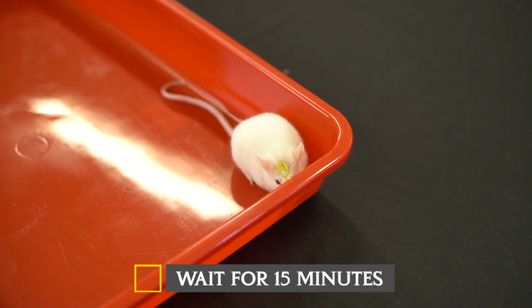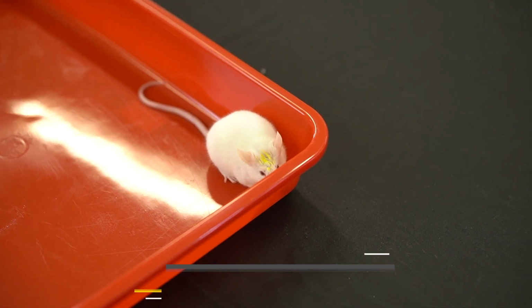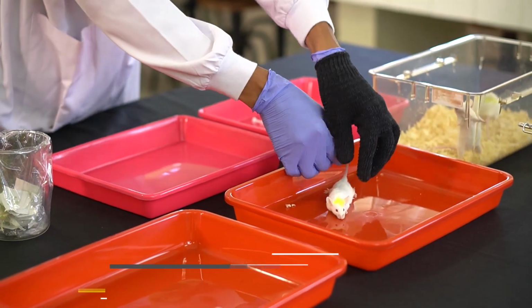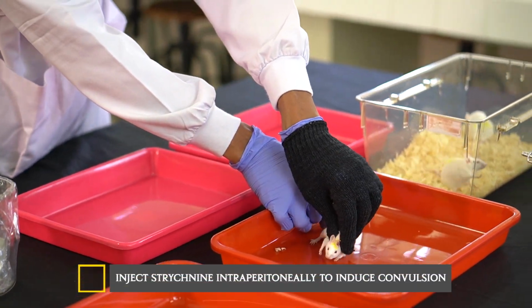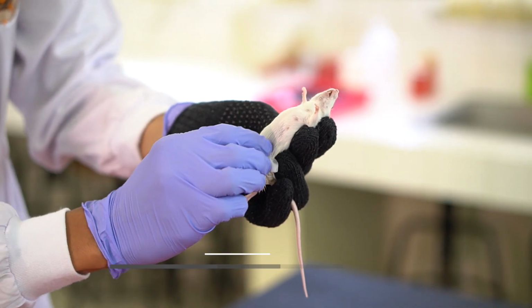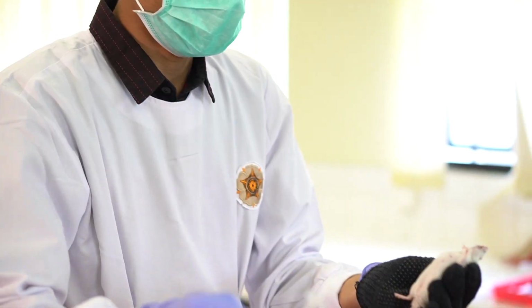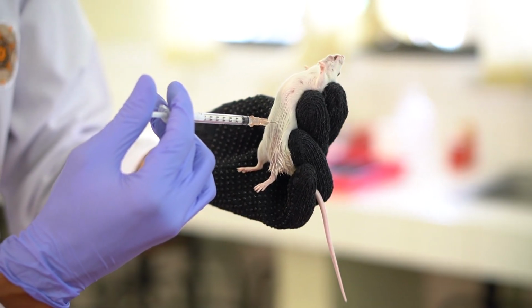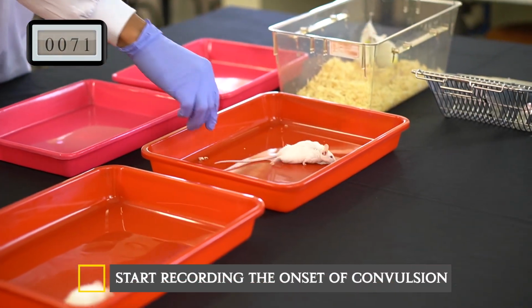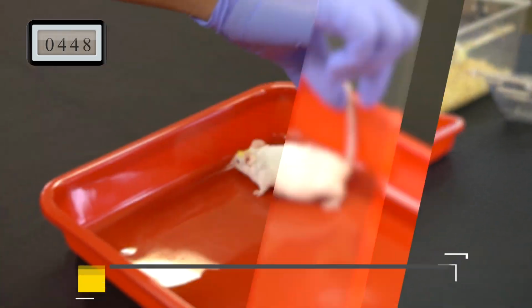Wait for 15 minutes. After 15 minutes, inject the strychnine intraperitoneally to induce convulsion. Turn on the stopwatch to start recording the onset of convulsion.